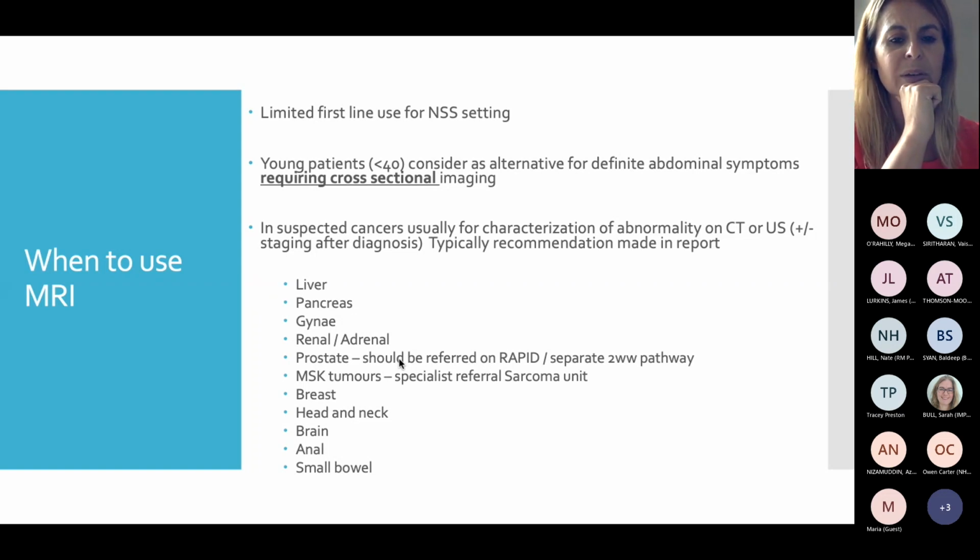When you might be requesting it typically would be for further characterization of an abnormality on a CT or an ultrasound, or if the MDT you're referring to has asked you to do it to expedite the staging, as things are referred. So sort of bundling of tests prior to the MDT that we know the MDT would then just need to request. Typically, a recommendation in these circumstances will be made in the report, so you'll know what to do.